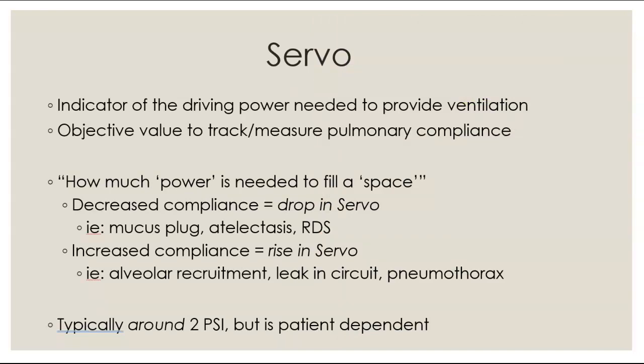Servo pressure. So servo pressure is something specific to the high frequency jet ventilator. It is an indicator of the driving power needed to provide ventilation. So essentially that is an objective value of how much power is being used to ventilate, how much the ventilator is working to get air in. I'm trying to think of different ways to explain this to help different learners. This is also great for tracking and measuring pulmonary compliance.